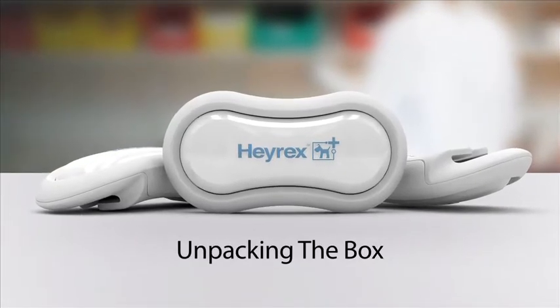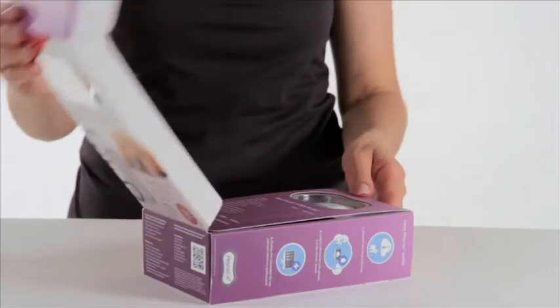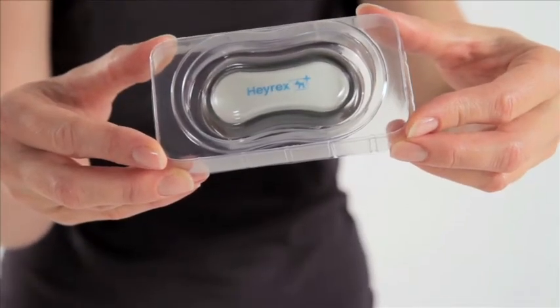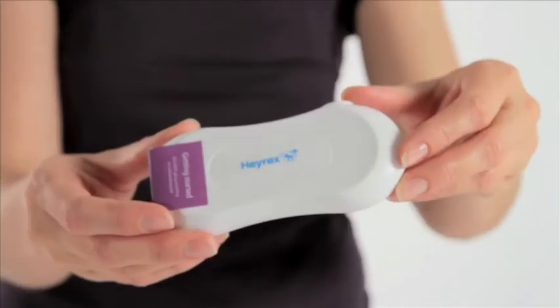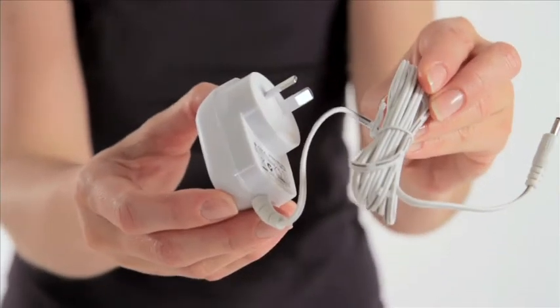To unpack the box: the box opens from the top. Inside you will find a biosensor capsule, spare batteries and a collar adapter, receiver, aerial, network cable, and a power adapter.